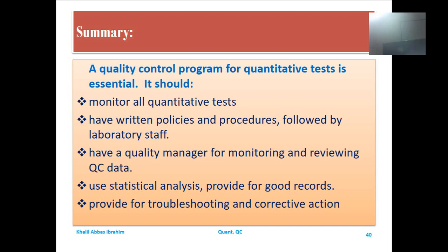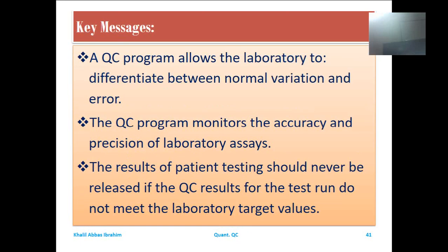Due to its importance, the manufacturers of the kits, the equipment or any components of the system adopted in the laboratory should make the end users aware of the troubleshooting expected, providing them with the procedure they should carry out to overcome and resolve those problems. Having an effective quality control system in place makes it possible to handle the problems of troubleshooting of the system.